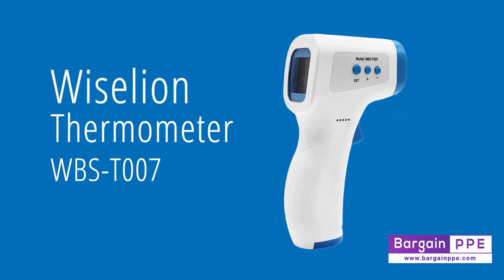This video will provide an operational overview of the Wiselion WBS T007 thermometer.